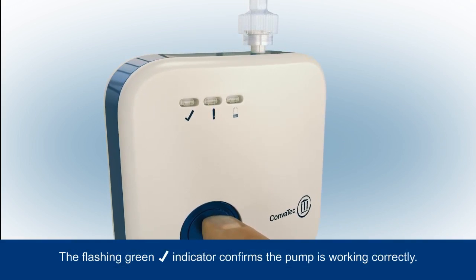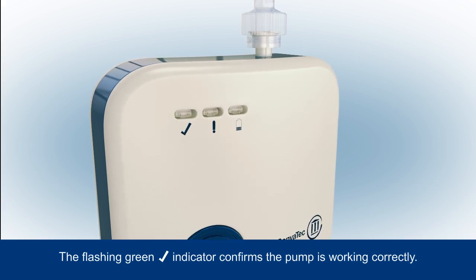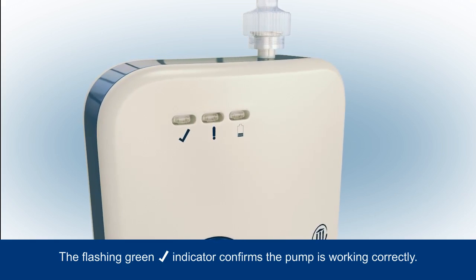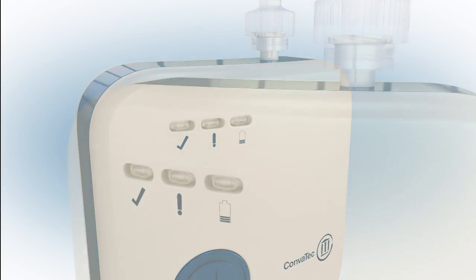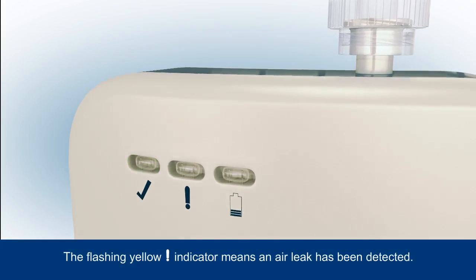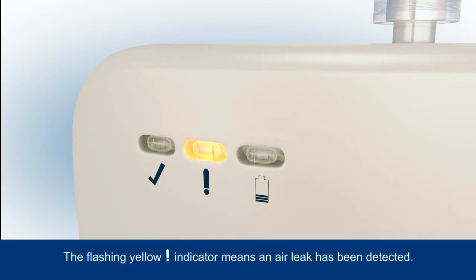The green tick indicator will start to flash to tell you the pump is working correctly, and will continue to flash regularly to indicate that the system is turned on and functioning properly. If an air leak is detected, this will be indicated by the flashing yellow warning indicator.